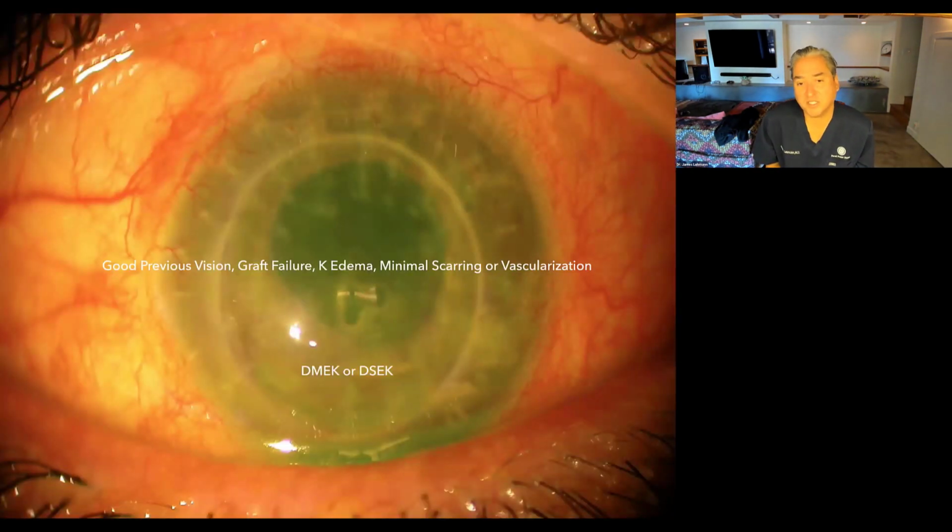And so here's an example. This was a patient who presents with a failed PK. You can see it's edematous. Right in the middle of that picture is a bulla on the epithelium. So what would you do in this scenario? They had good previous vision, but they have graft failure with corneal edema, very minimal scarring. So in this situation, I think endothelial keratoplasty would be the best option for that patient.